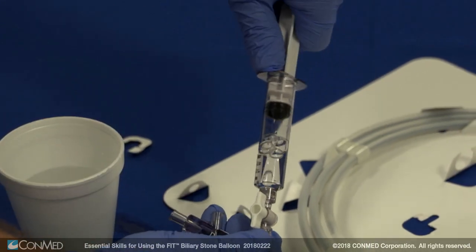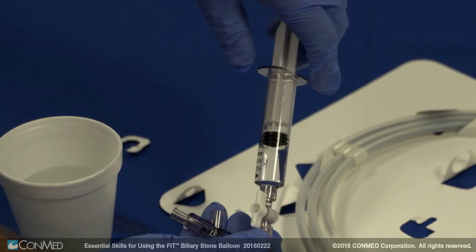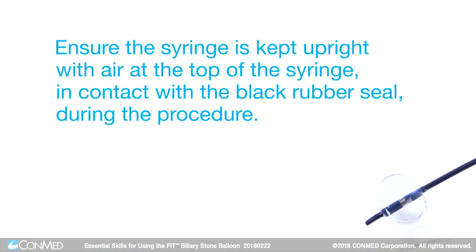Pull the syringe back for 5 seconds. Then, slowly release the plunger and close the stopcock arm. The Fit Stone Balloon is now ready for use. Ensure the syringe is kept upright with air at the top of the syringe in contact with the black rubber seal during the procedure.